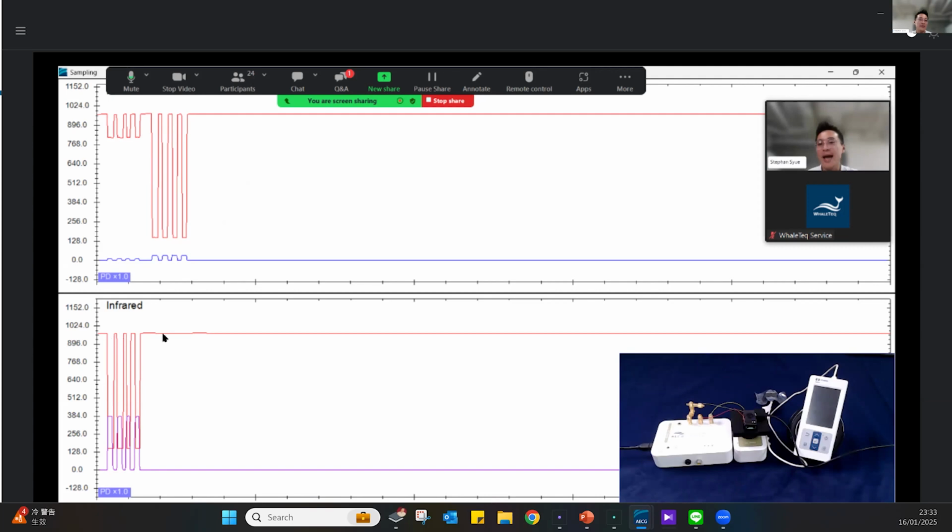It's normally active high, but once we detect the LED pulse from the device, we turn on our LED by dropping the voltage. It will do so 4 times as we detect 4 pulses in series each cycle from the wearable device. It does the same for the red. We detect the red pulse from the wearable, and we drop 4 times to turn on our LED 4 times to sketch the PPG curve for the signal processing of the wearable device.